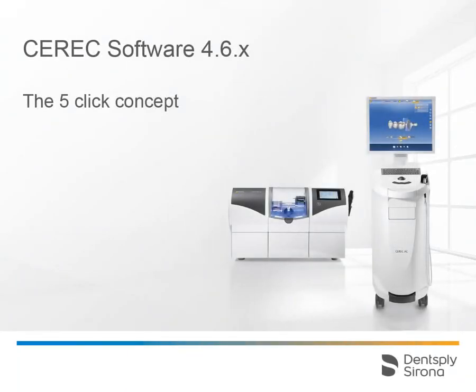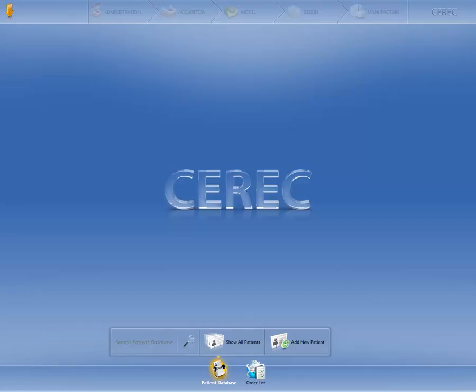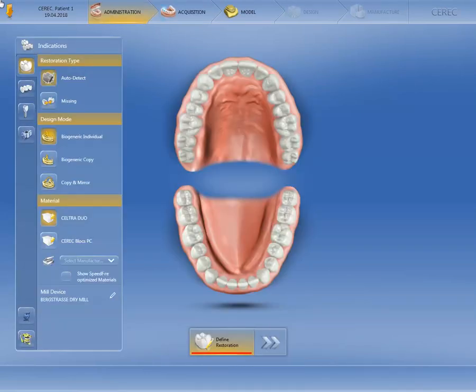Welcome to this video tutorial on the topic of the 5-Click concept from CEREC Software 4.6. First of all, we create our case as usual, but in this video we skip the sequence where the patient data is entered and switch straight to the administration phase. As this is a single tooth restoration and we want to keep the preset options for the restoration type, design mode, and material in the window under indications, we simply click on the position of the restoration in the odontogram.